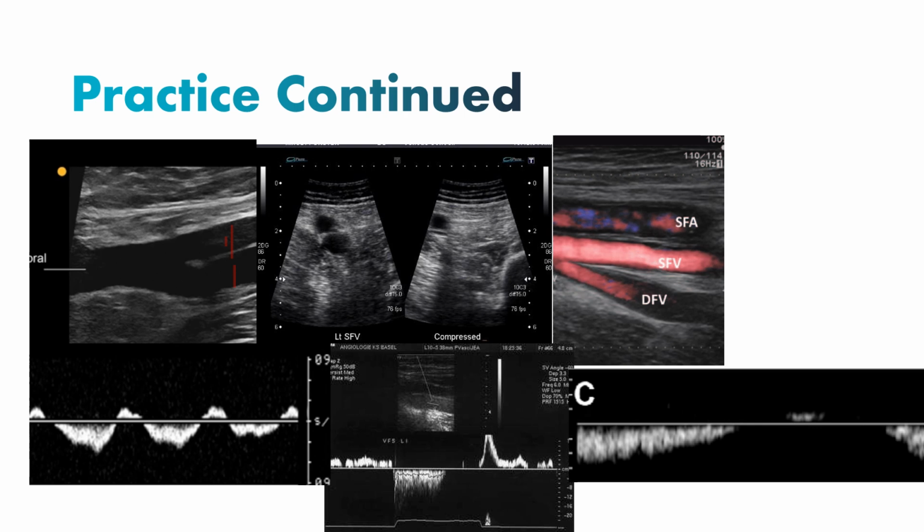They've turned back to long. They probably had to augment here. It looks like they've also moved into power color or power Doppler to pick up those lower flow velocities. But we see nice, good, full lumen filling here, indicating that there is no distortion from a clot taking up part of that lumen. Then we're going to go ahead and turn on our spectral Doppler. And here we can identify that there's good phasic flow. With respiration, you're seeing those gradual changes with every breath.